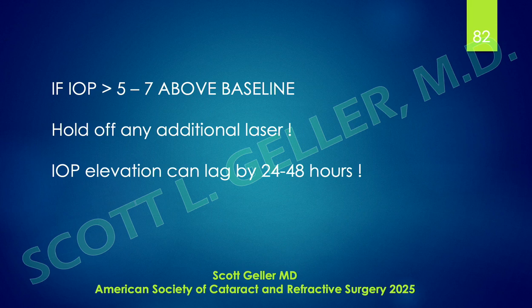I do have to say I did have a patient from out of town who came in. He was a pseudophakic, and I did not consider what he had to be excessive laser. But he called me a week or two later, and he said, everything looks whitish. I said, what do you mean by that?